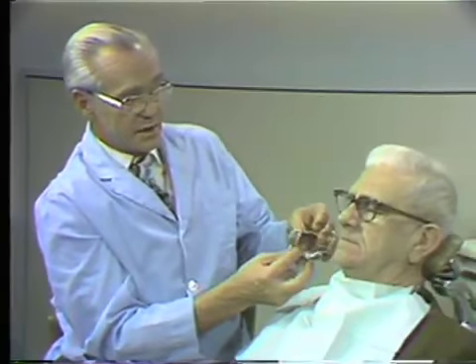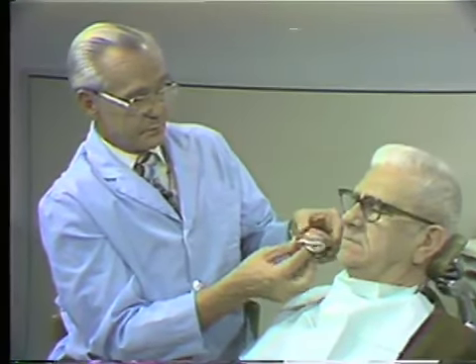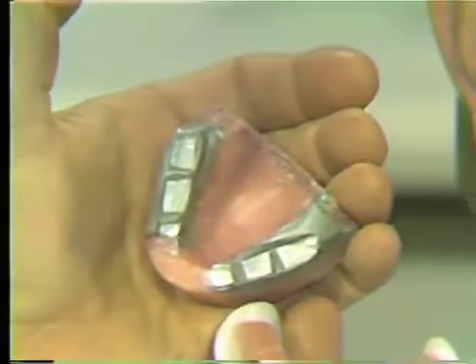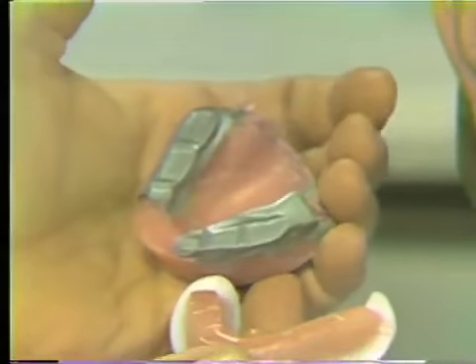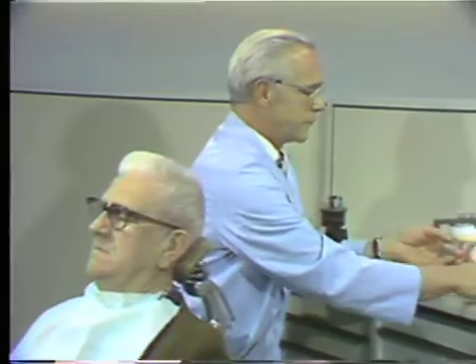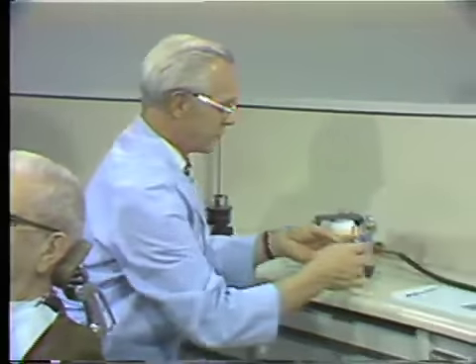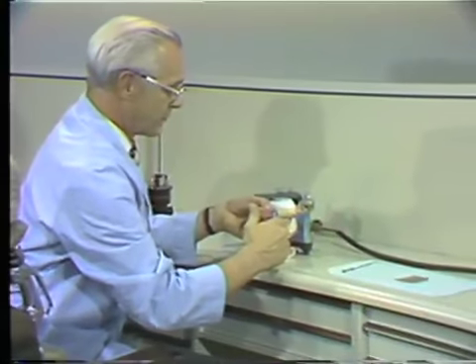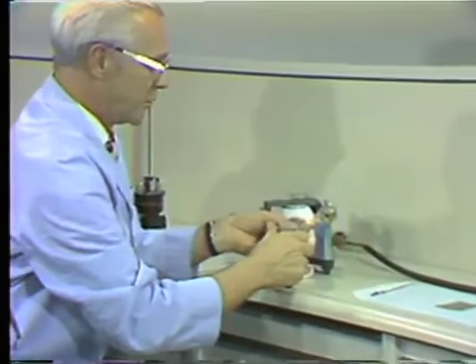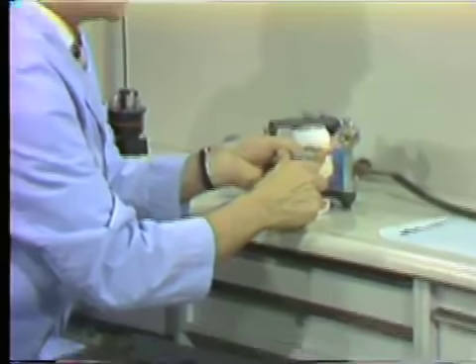We now have excess, and we will separate. Now we'll go back to the laboratory bench and cut off the excess, both buccal and lingual.